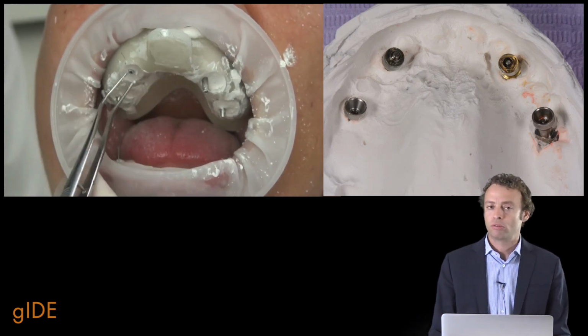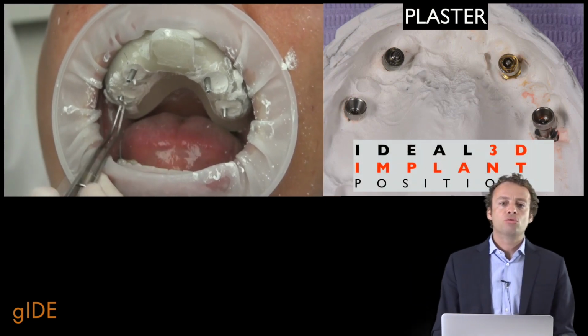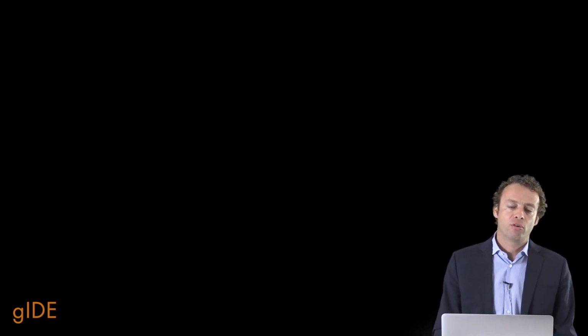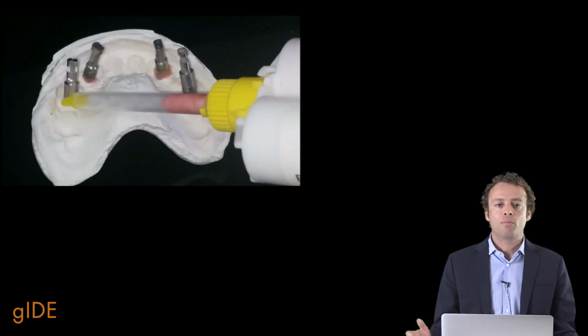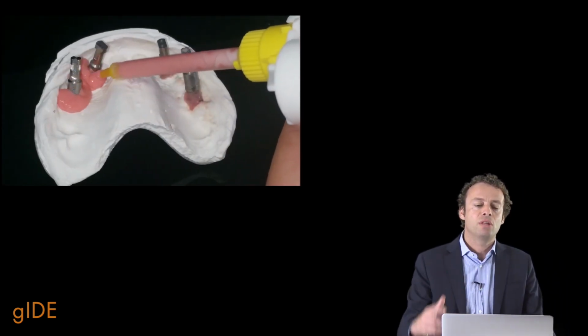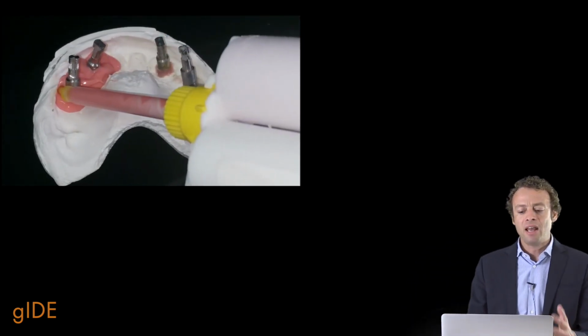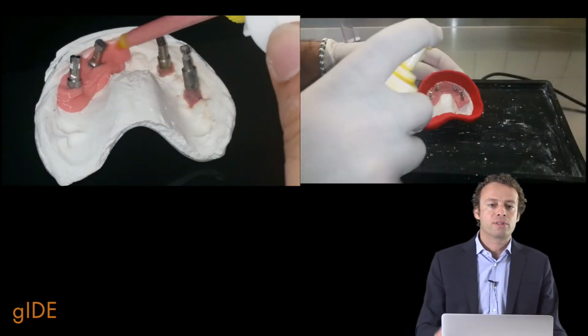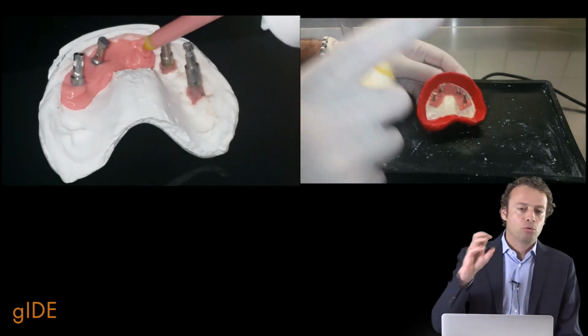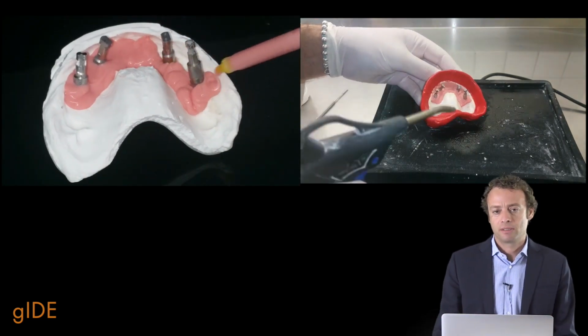it is absolutely not good. So we ask the dental technician to create a model from this impression, like they normally do in the normal routine. So we create the soft tissue morphology using a pink silicone, and after that we pour some plaster on it in order to create the models.